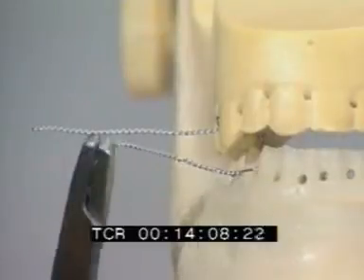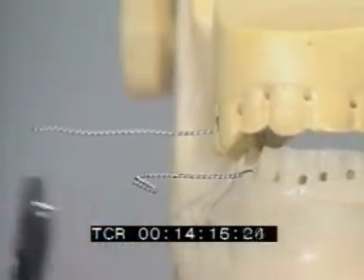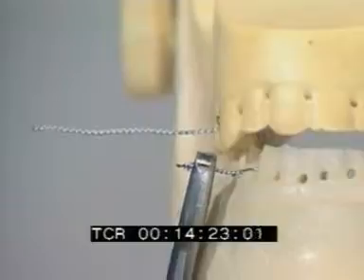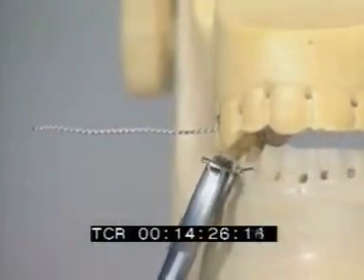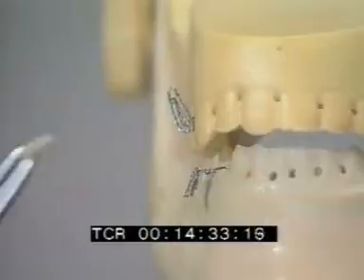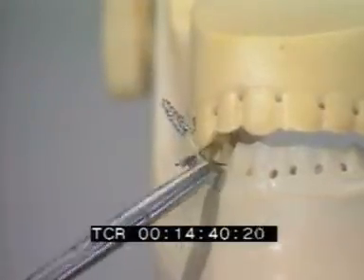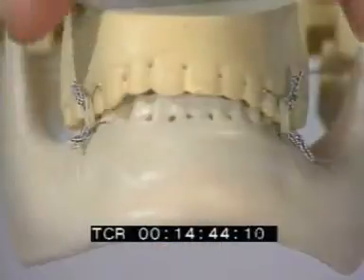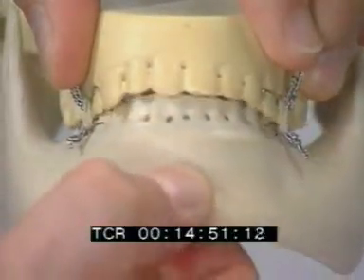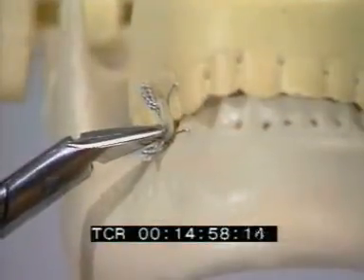If complete immobilization is not tolerated, or if less stability is needed, elastics can be inserted. To accommodate elastics, the wire ends are bent together to form little hooks. The elastics are then inserted around these hooks. Ernst ligatures are easy to remove.